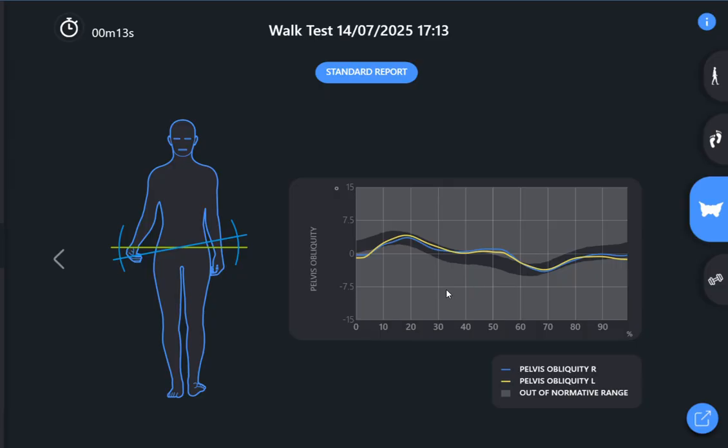to show where we really need to be directing this treatment, which is getting this low back flexibility, this pelvic rotation, left to right rotation going on as she moves into that push-off phase. So this information just adds another level of assessment to help make sure we're addressing all the issues that may be of concern.